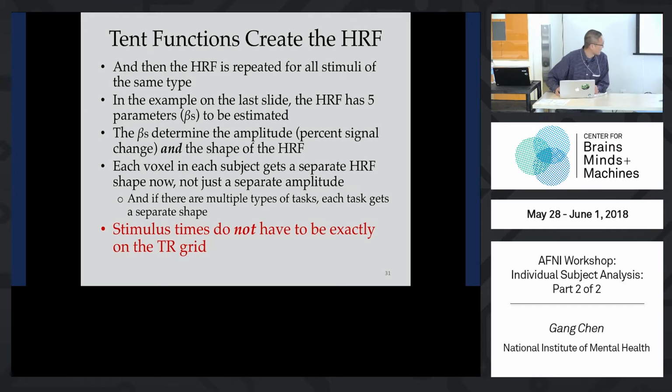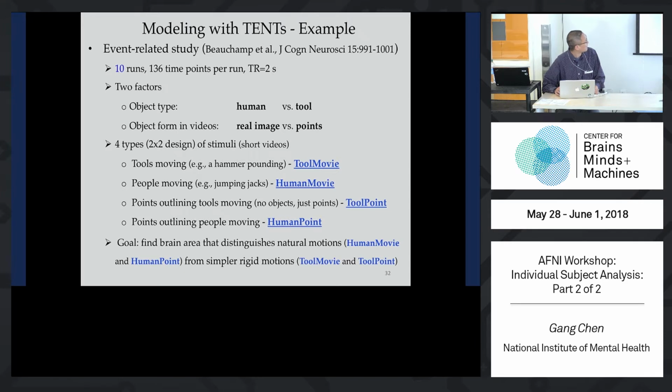Another subtlety is that in AFNI, usually this approach, just like the typical modeling approach with one standard curve, does not require that the stimulus timing be locked to the TR grid, unlike the other implementations available in software packages.